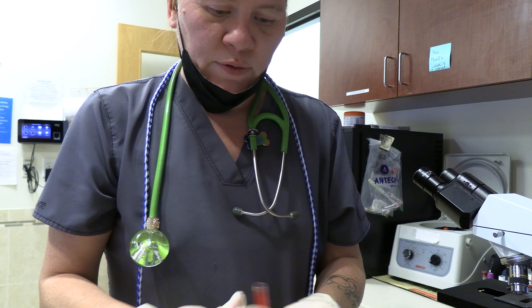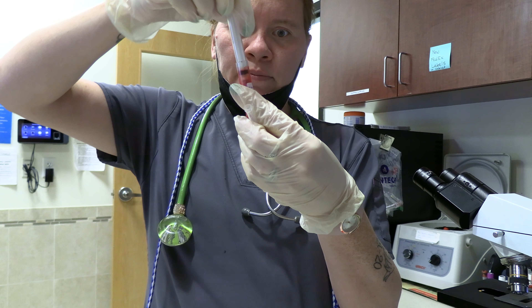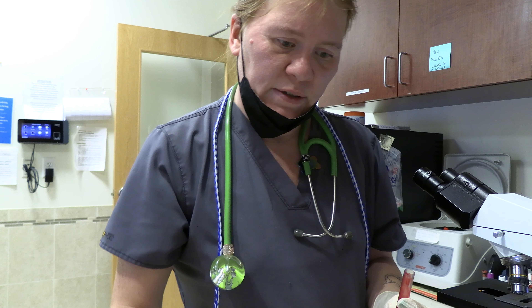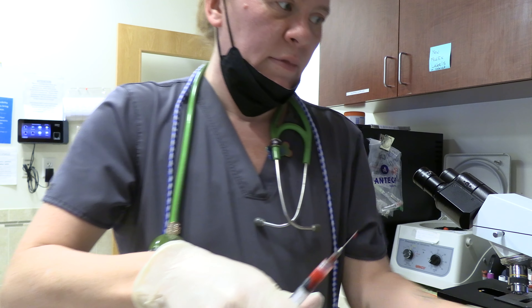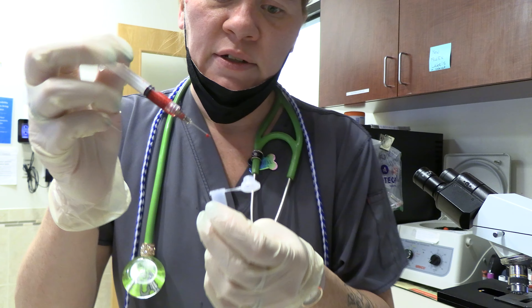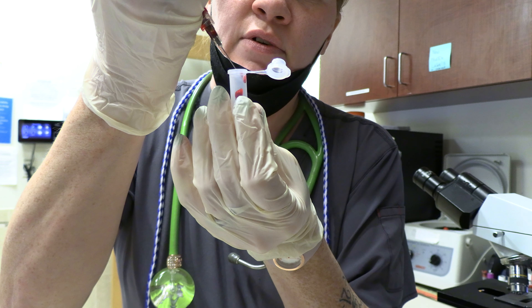Then we are going to take some blood out of here and take five drops of Squishy's blood. One, two, three, four, five.